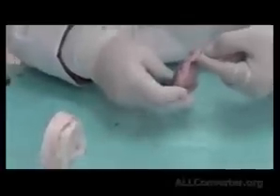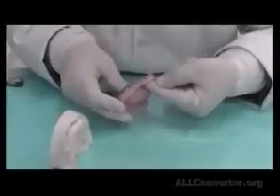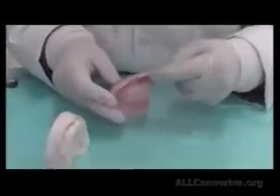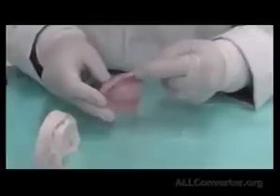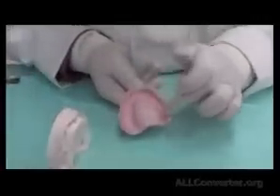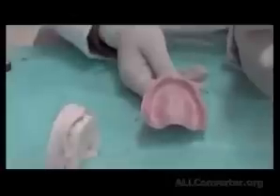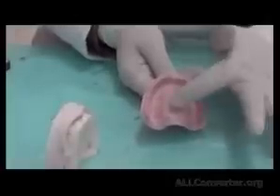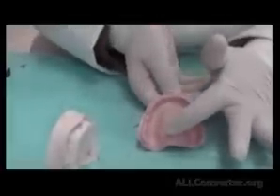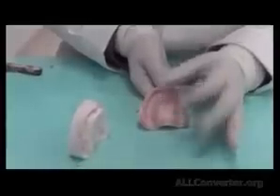If I have found that my finger goes in here more than here, that means it's under-recorded. So what I could do in the patient's mouth, I could add green stick border molding material to fill in this space. So this is the check we do. The surface is continuous. My minute bubbles are acceptable. If larger than this, I might correct it using some green stick, add a bit of green stick, put it back into the patient's mouth and press it, and come back and remove any excess on the fitting surface. This might be sufficient. If it's larger than that, we need to repeat the impression.